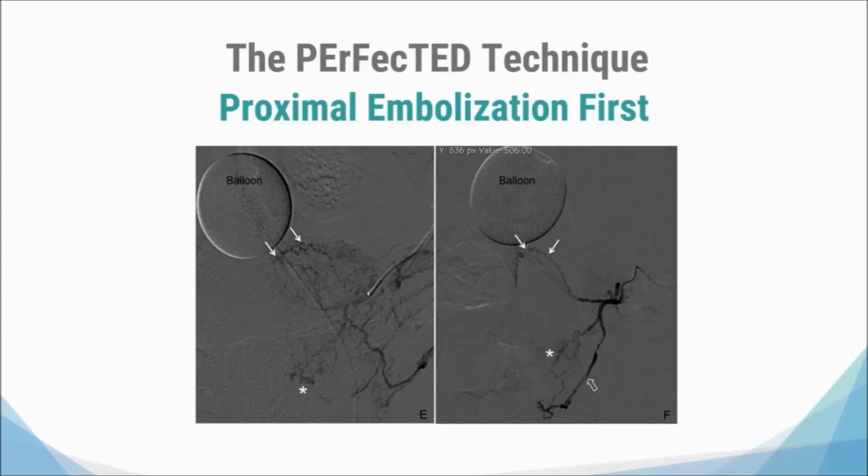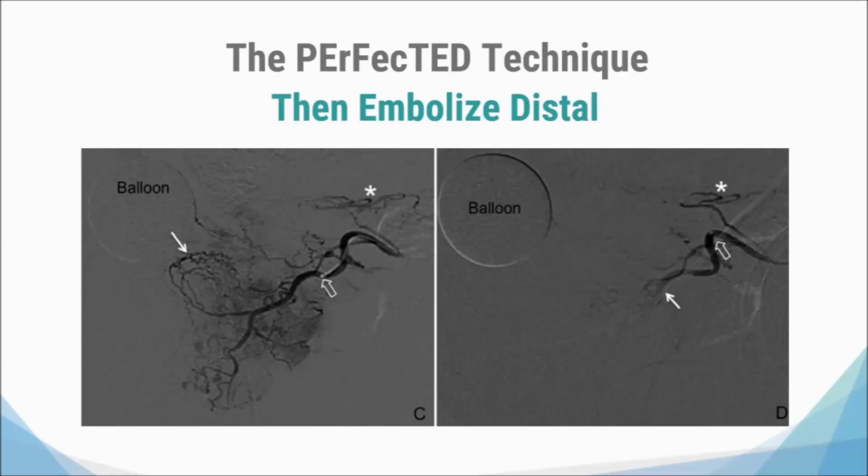So once you have the microcatheter distal to any bladder branch or rectal branch, you can start your embolization. When you decide to do the PErFectED technique, that is the time you should advance your microcatheter deeper into the central gland branches and inject directly into this area to get more ischemia. It is important to remember that this area is where we have the BPH disease. But after achieving this area, you should move the catheter back and try to advance into the capsular branch and get more embolics into this region to avoid recanalization and get more infarction of the prostate.